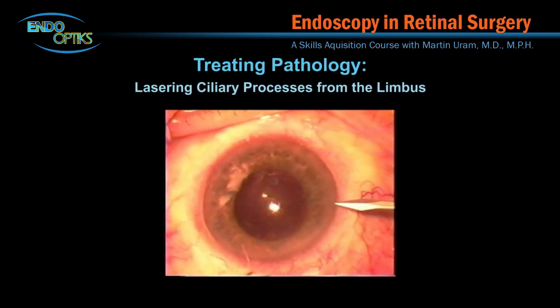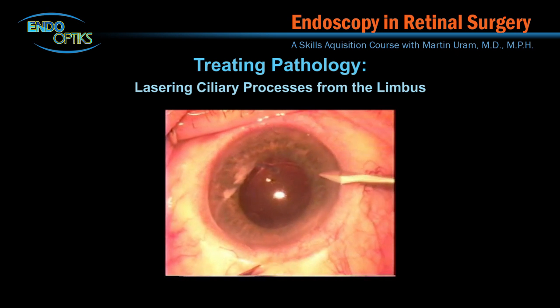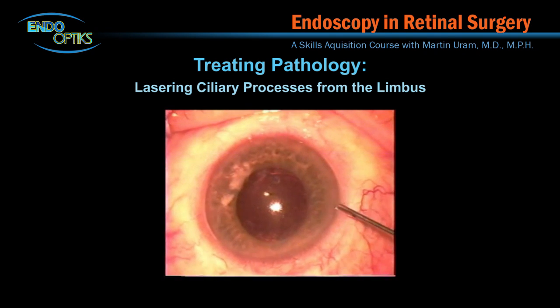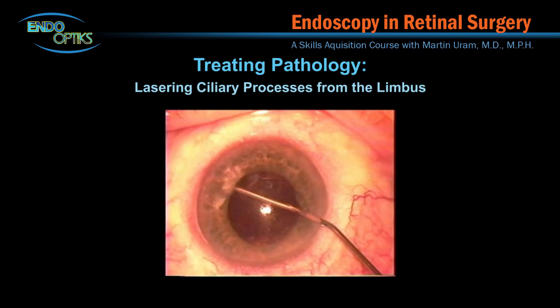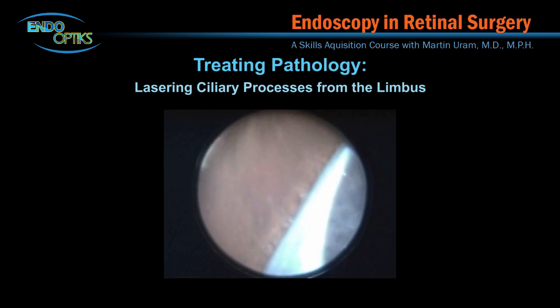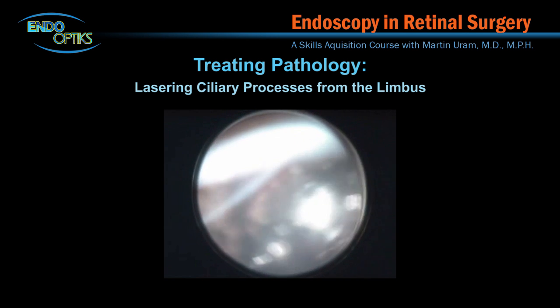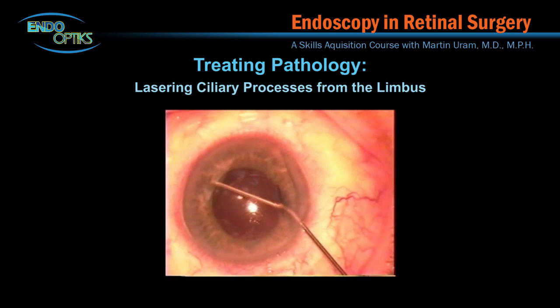Let's talk about endoscopic cyclophotocoagulation, or ECP, for a few minutes. This can be a valuable addition to your practice capabilities. If you acquire the skills to perform this technique, you can address your retinal patients with glaucoma problems. Neovascular glaucoma is the most obvious target, and a great therapeutic option for these patients is vitrectomy, PRP, and ECP. You can also expand your capabilities to treating other forms of glaucoma.